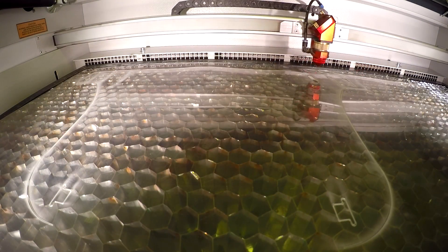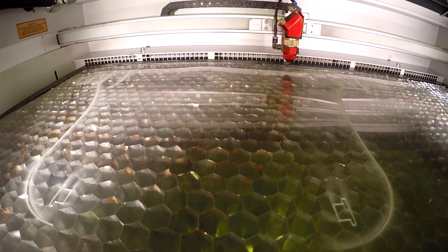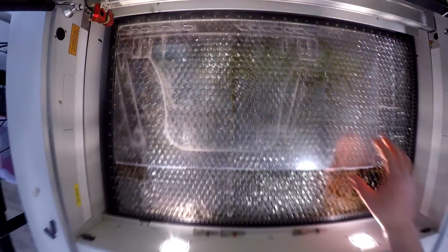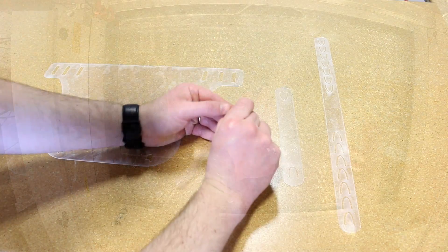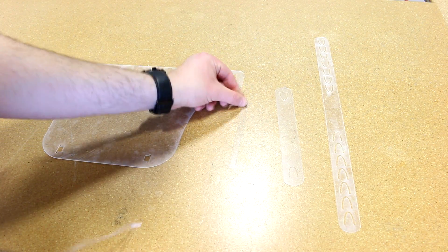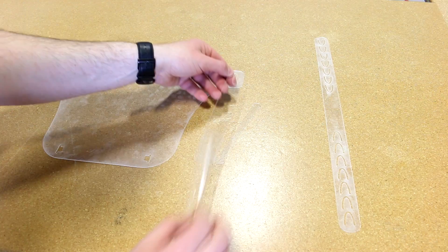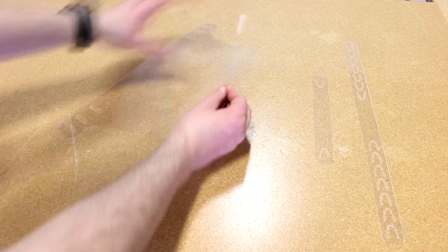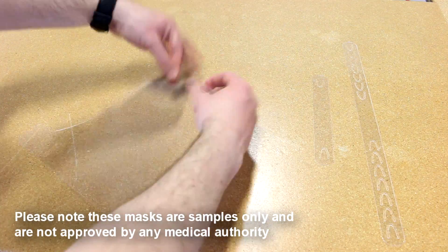It typically takes under two minutes to cut one mask and only a few seconds to assemble it. This design was created with the 0.018 impact acrylic in mind in order to provide a thicker alternative to the 0.007 design. Some customers requested a thicker shield than the 0.007 PET material, and the 0.018 impact acrylic is more readily available from Trotec than the PET.